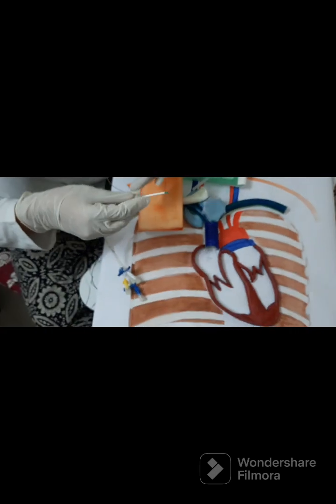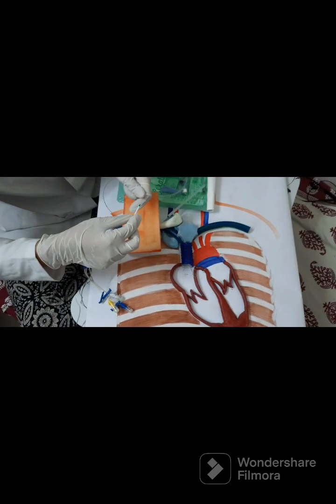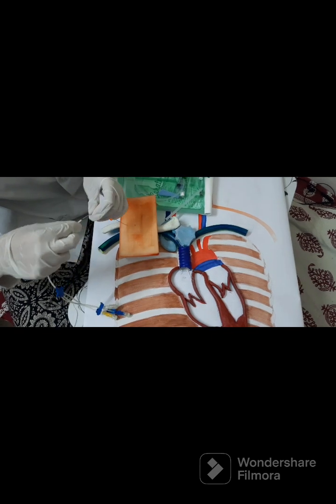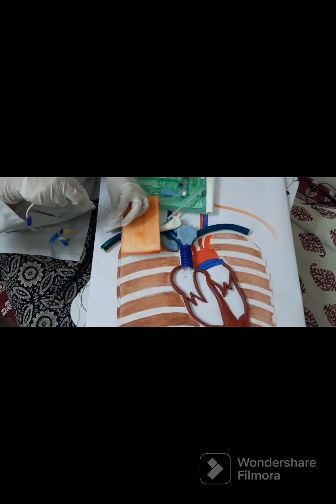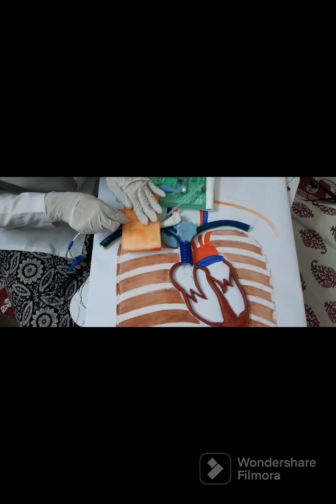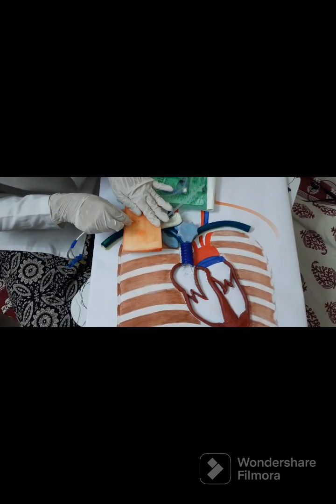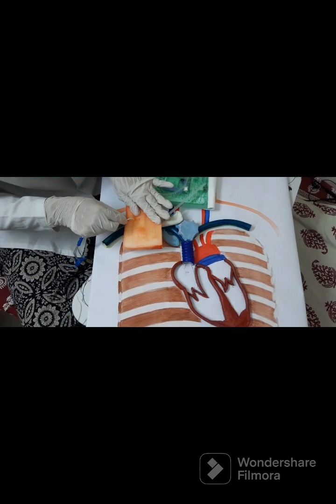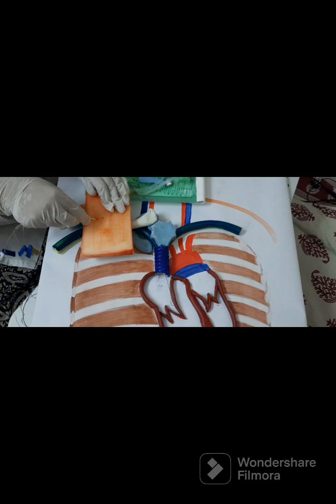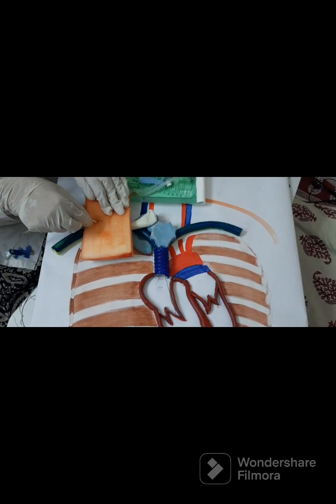Now we will pass it over the guide wire so that it can enter the vein. Now you can see that I am inserting this central line.